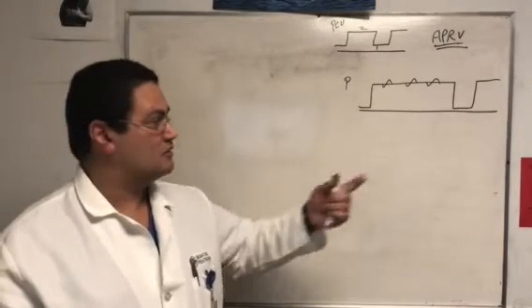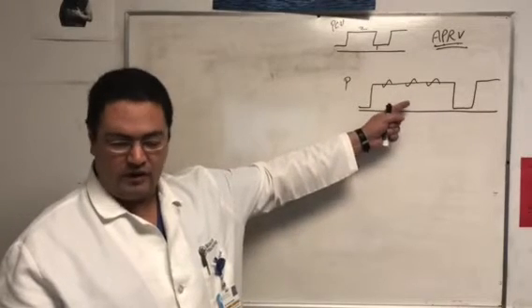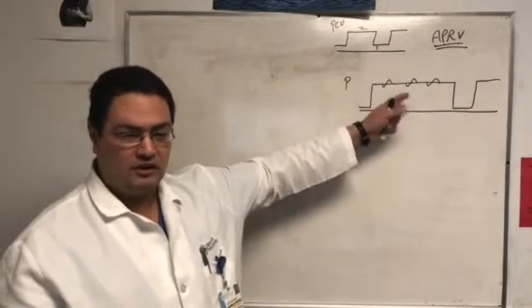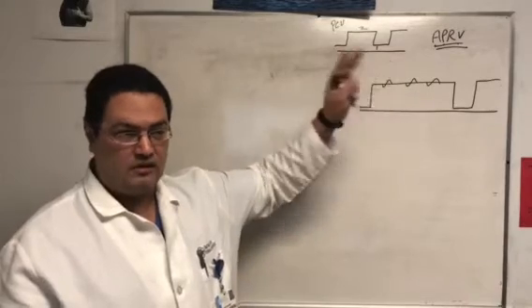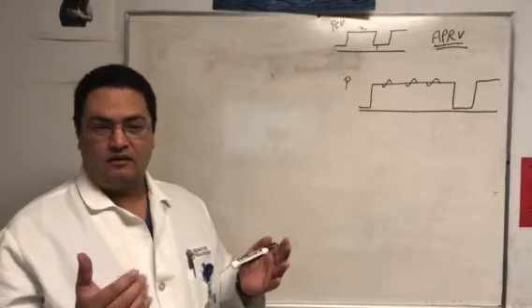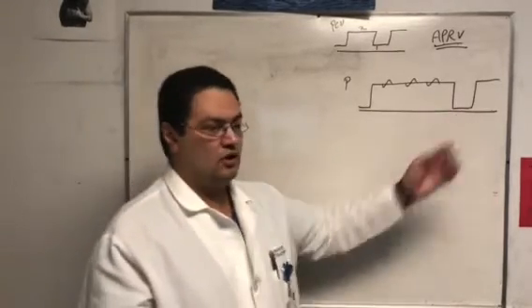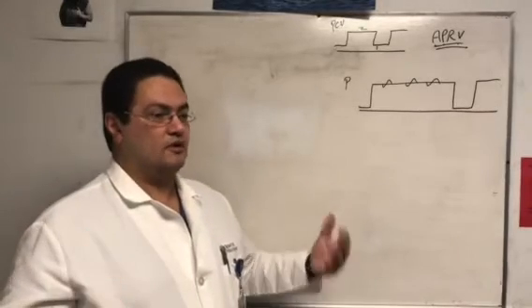The first claim to fame is that it will maintain a very long I time without the need for paralysis. And the second claim to fame, and you can count with me, is that it requires less sedation, because the patient doesn't feel this that much. It's just for a long period of time the patient is like this.